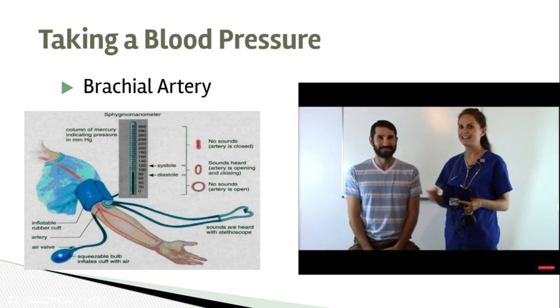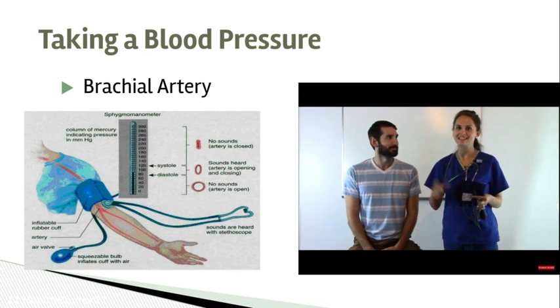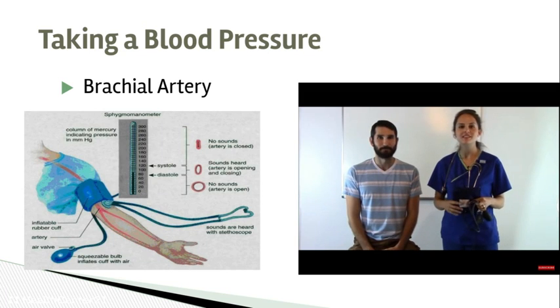Here we have our patient. It is my awesome husband, Ben, and he is here to be my test dummy for doing our blood pressures.